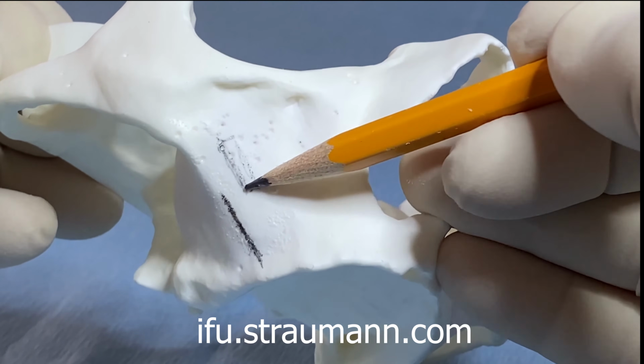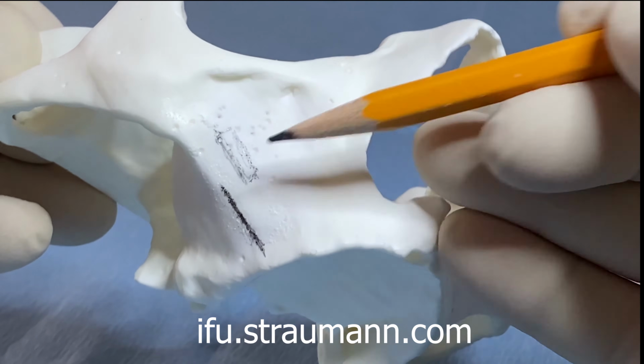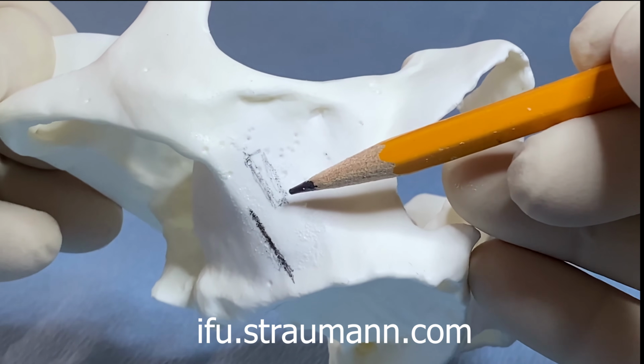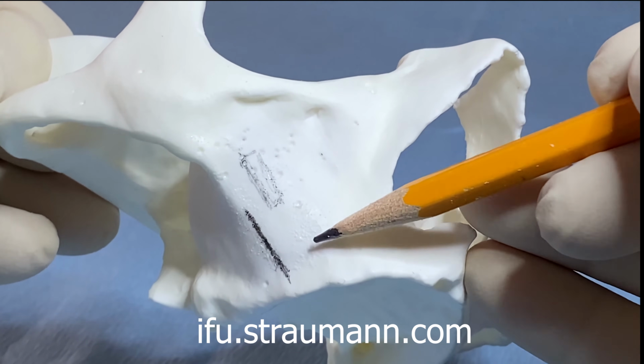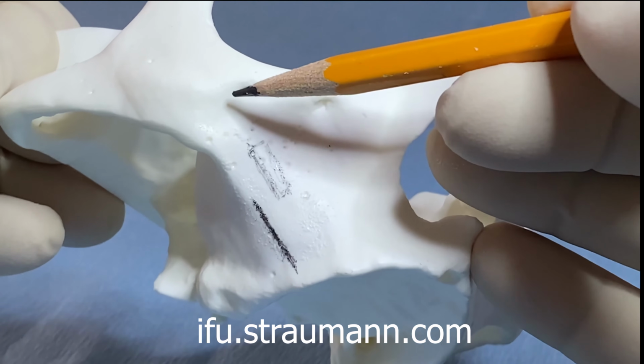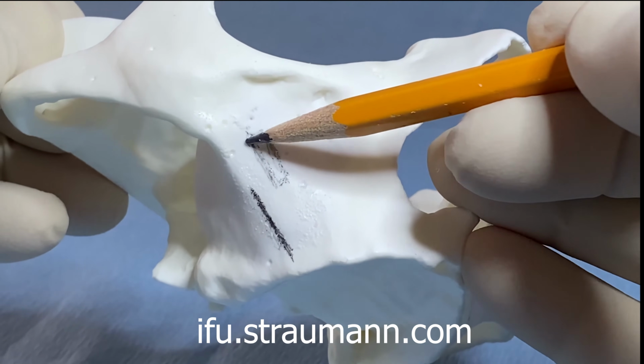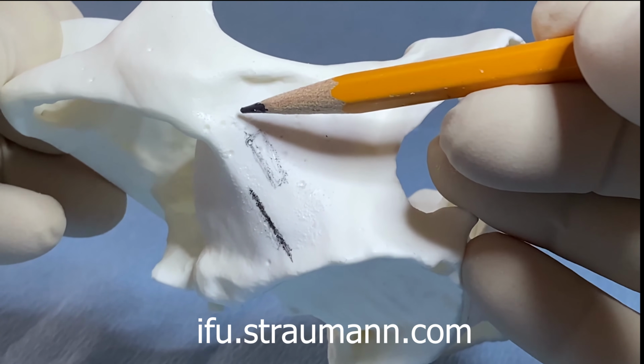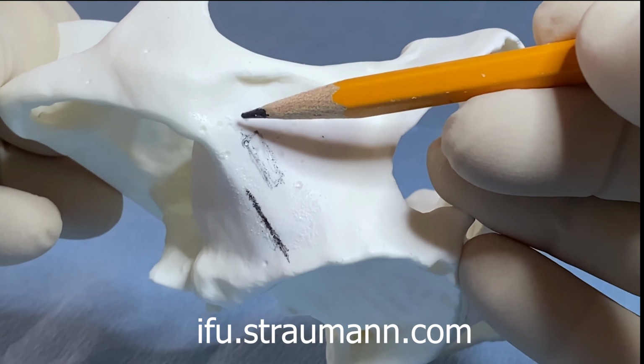So this is the size of our window. Now, the more inexperienced a person is, you can make it longer so you can visualize the path of the drill. But the point of the sinus window is to be able to look and see the base of the zygoma or the roof of the sinus.